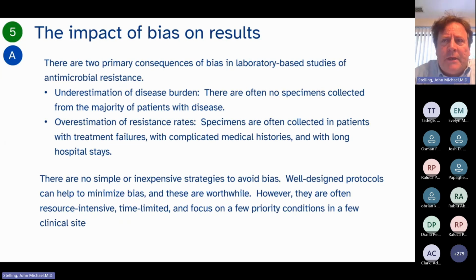People often ask, well, what threshold should I use for deciding on drug A versus drug B? And you see some studies where they say often if it's a life-threatening infection, like meningitis, or it's an infection with great public health concern and transmissibility like gonorrhea, people often say 5%. We want the drug to be working 95% of the time, but that's only in an unbiased sample. In a biased sample, there's not an exact number. So 30% resistance to ciprofloxacin sounds like a lot, but that 30% resistance in reality might only be 10%. So we cannot set certain thresholds with biased data.